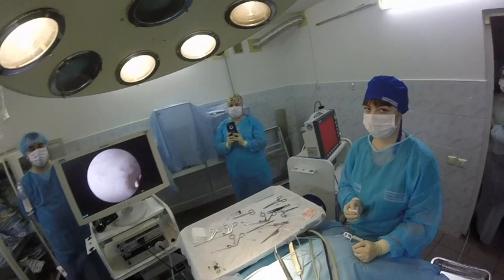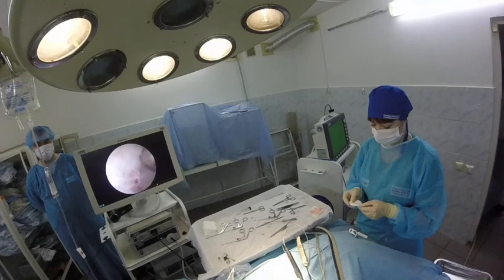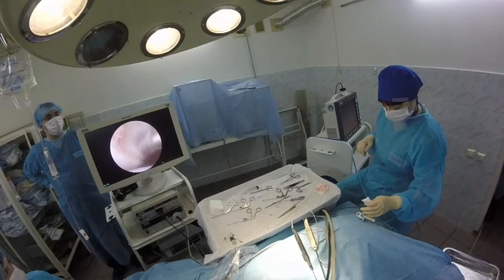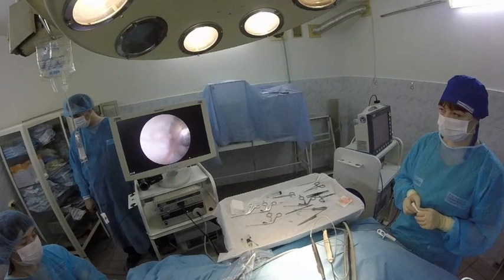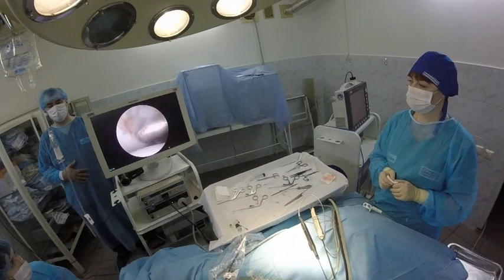I need Noltrex. As you see, this is a real cool clinical case — I saw it, I think, twice: maybe one year ago and maybe three years ago. We call it fragmentation of the caudal part of the glenoid. Try to aspirate the fragment of bone.